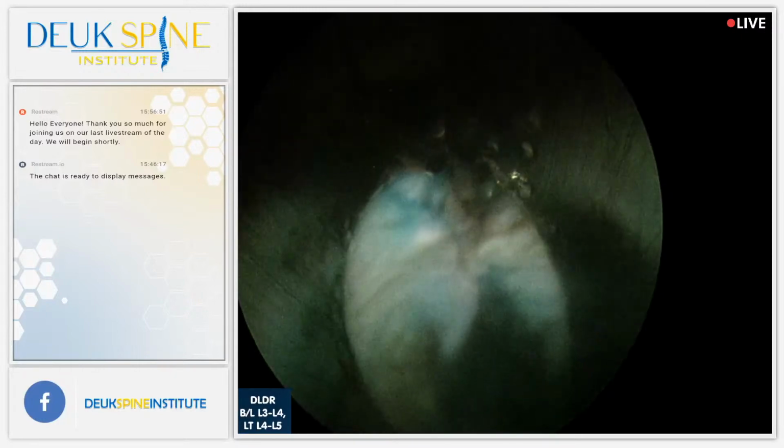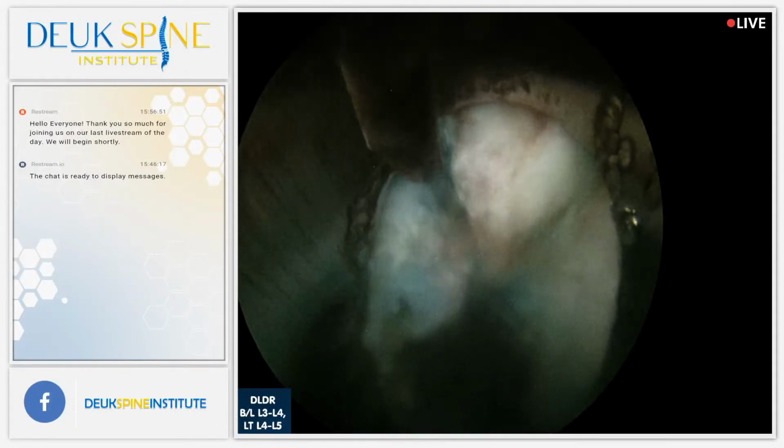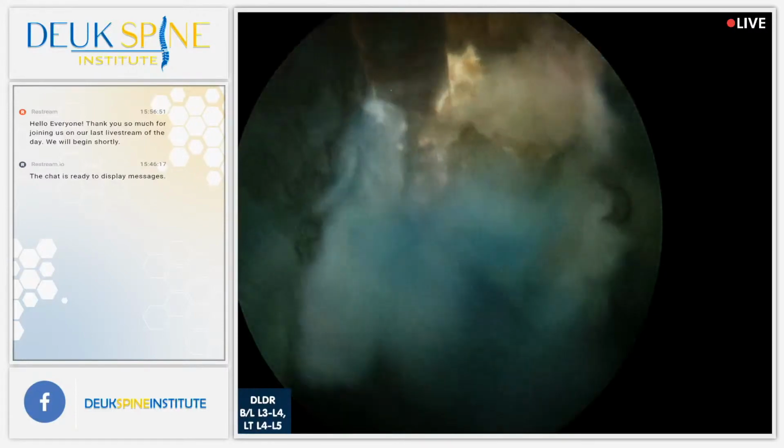Oh, look at the tear right there. You guys see the blue tear with the granulation tissue, the pink stuff on it right there? That's where all the pain's coming from. Look at that herniation. Here it comes.